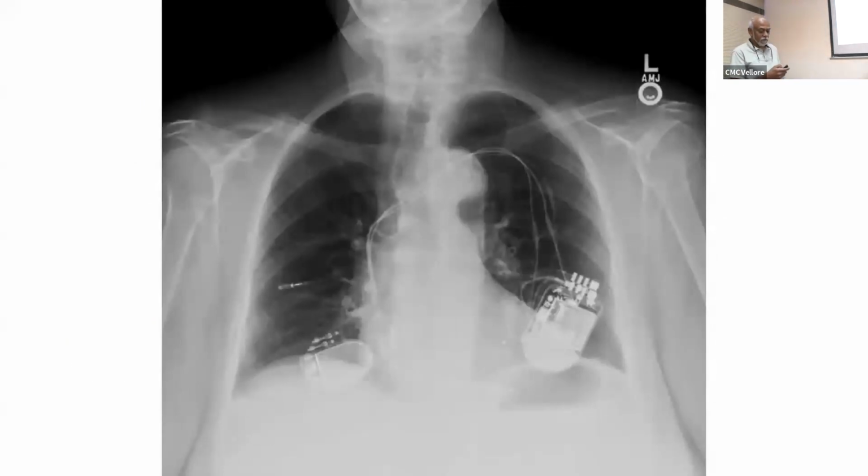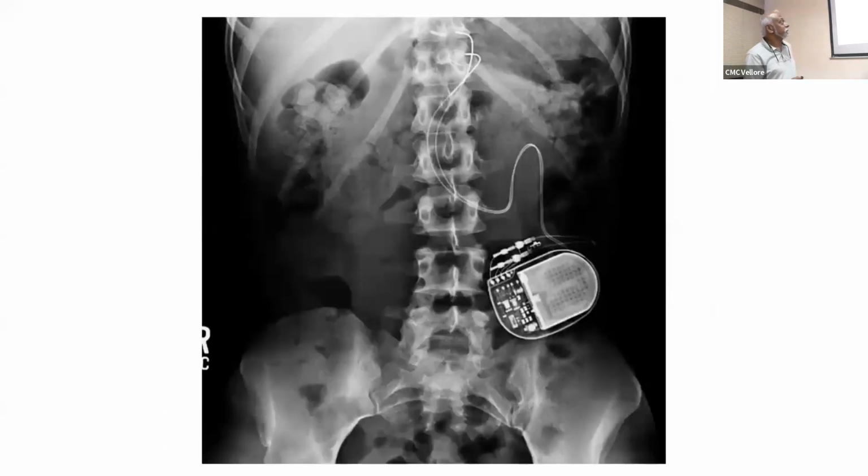Now, this is interesting. Any idea? This is a patient who has a cardiac pacemaker and a hypoglossal nerve stimulator. You can see the pleural lead. So you may see patients with both, and you can expect a patient with a cardiac problem and obstructive sleep apnea to have both of these. I actually asked the surgeon, we do quite a bit of this. So the surgeon said, hey, why don't you use this slide? Because you get more and more than one implanted device in the patient.